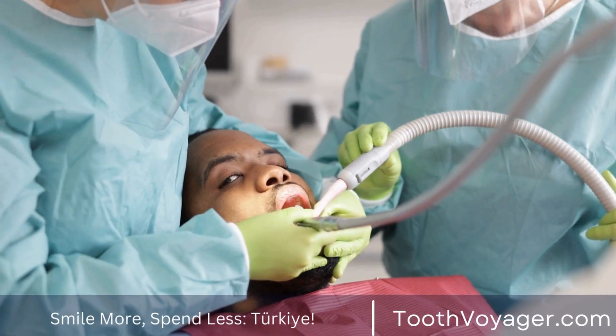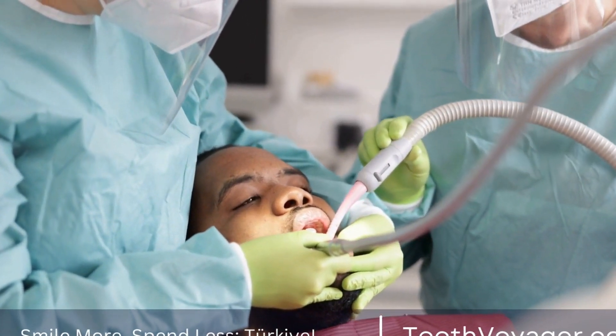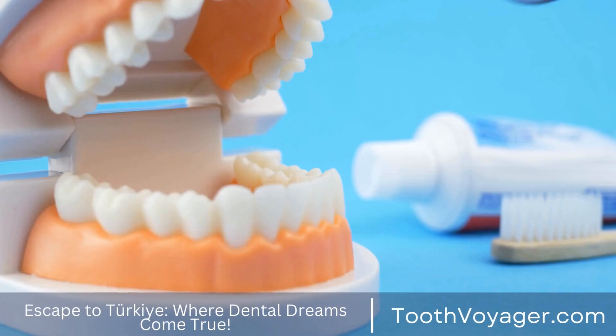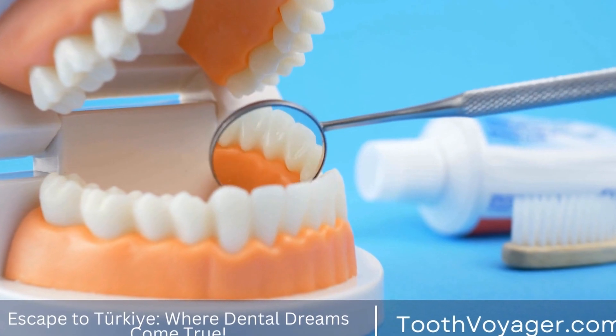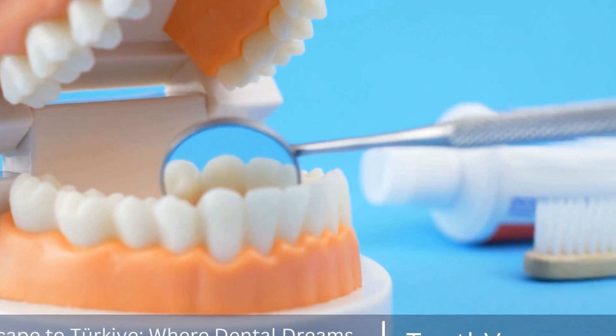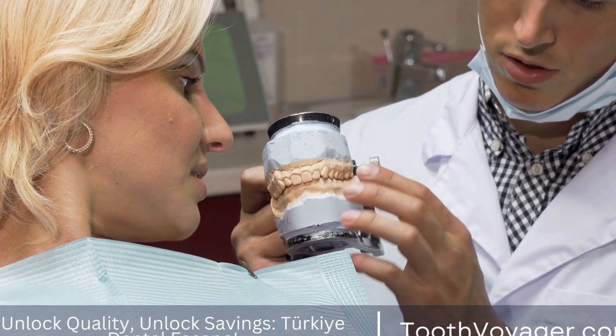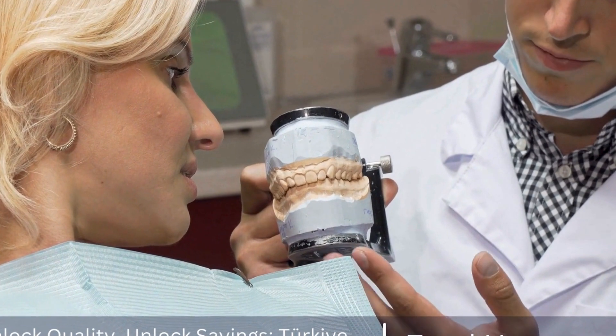To begin the customization process, the dentist will take impressions of the patient's teeth to create a mold. This mold is then sent to a dental lab where skilled technicians will use it to craft the custom crown. Using advanced technology and precise measurements, the technicians will carefully sculpt the crown to ensure a perfect fit.